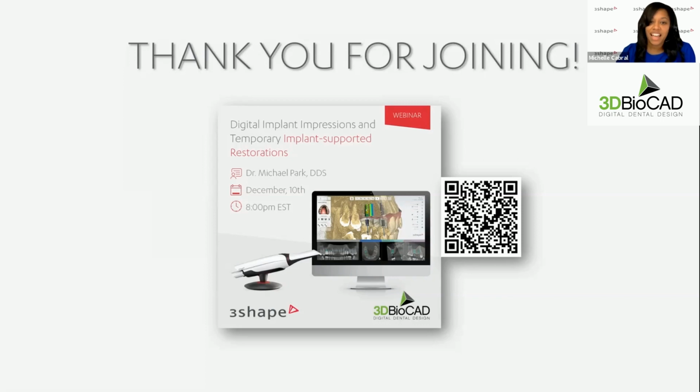Okay, great. Can you use Implant Studio as a DICOM viewer without having the intraoral scanner? Yeah, I can answer that too. Sometimes, yes, that's a very good point. Sometimes my doctor just took only a CBCT and sent it to me for a quick review, to check whether it's possible or not. If you have a DICOM file, we can import it in Implant Studio without a surface scan.